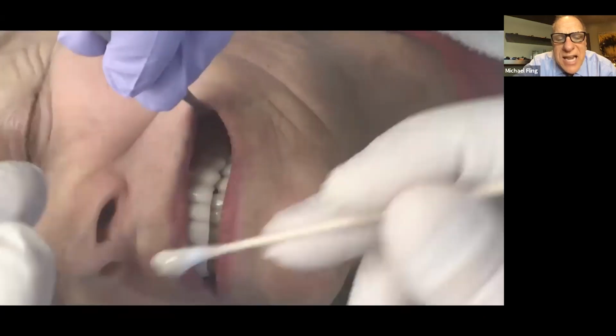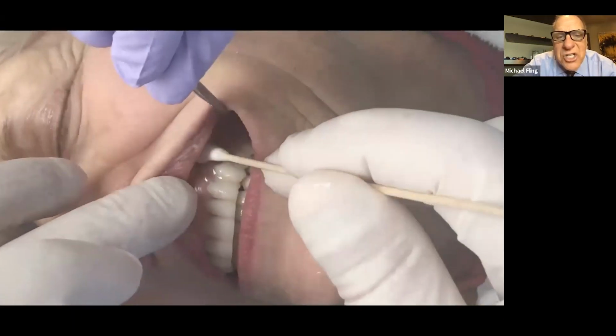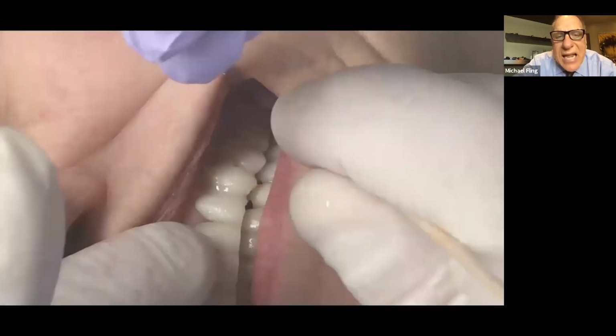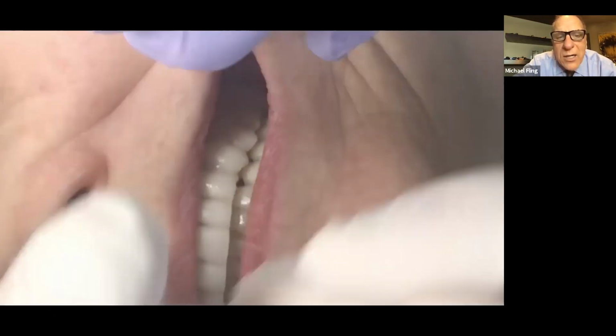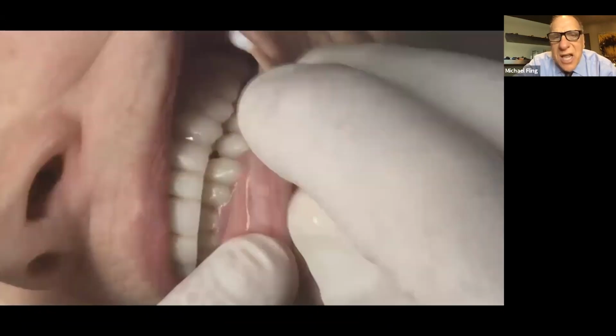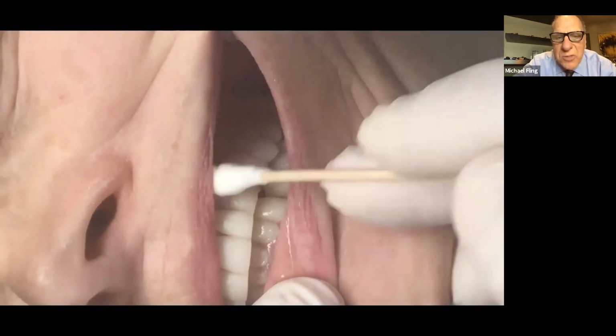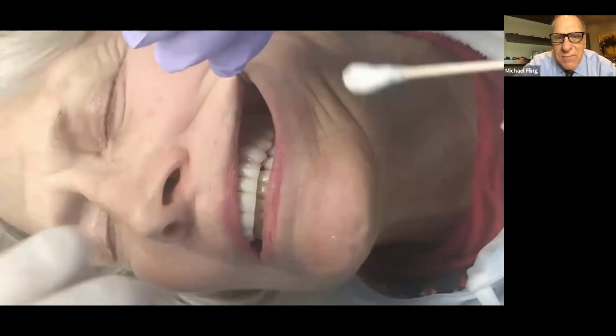So unlike the technique where I used to use a stent to do this, I don't seat it all the way. She closes and she helps me identify where the correct occlusal position is. What this has done for me is dramatically reduce my occlusal adjustment time on these big cases.